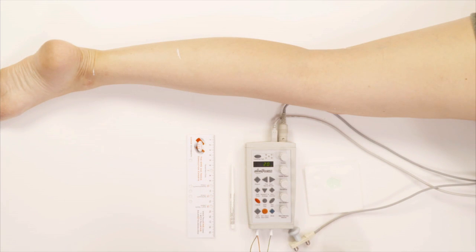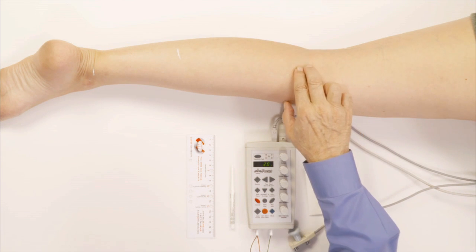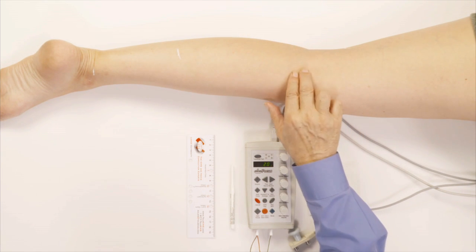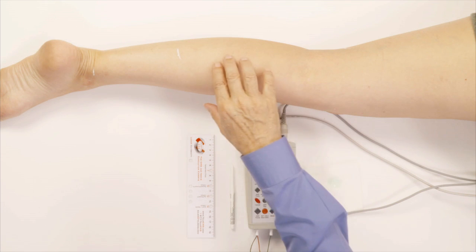Okay, the last nerve conduction in the lower extremity is the H reflex. We're going to stimulate at the knee right here. In fact, we're going to stimulate the tibial nerve at the knee.